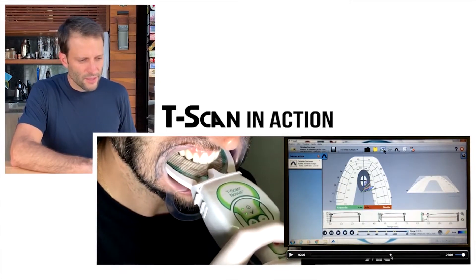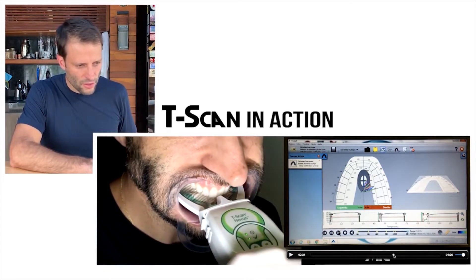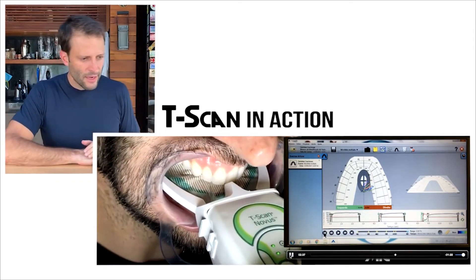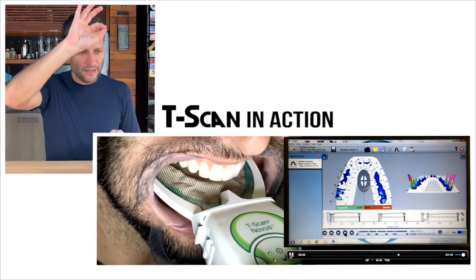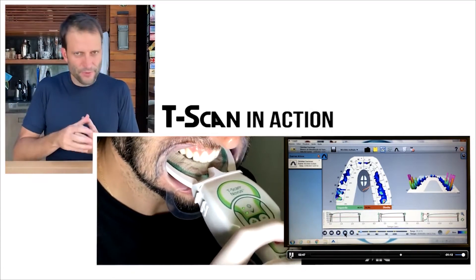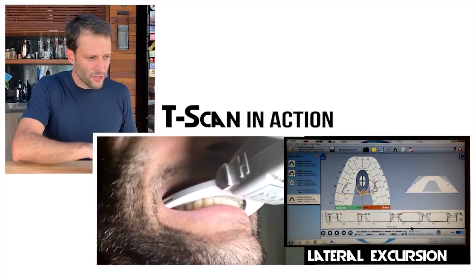On the bottom of the screen you'll see a two-dimensional graphic. As I bite, you're going to see the cursor moving — the moment the teeth are touching, the graphic goes up, there's a plateau at the top when teeth are together, and then everything drops when I open the bite. It's a very nice tool to evaluate maximum intercuspation.